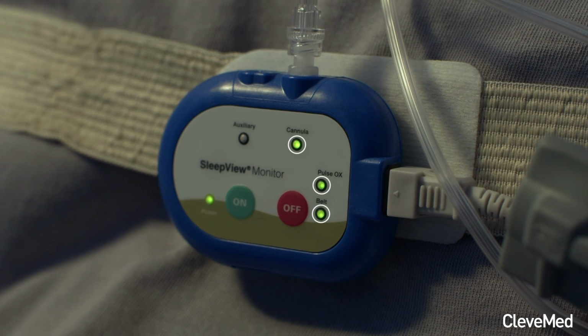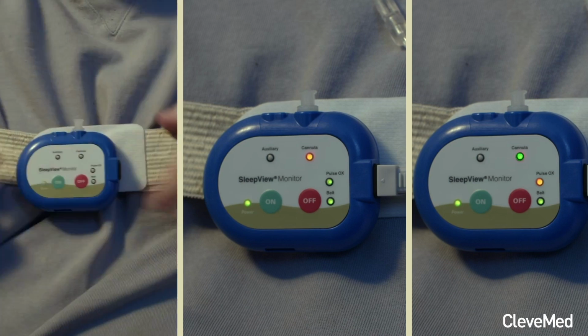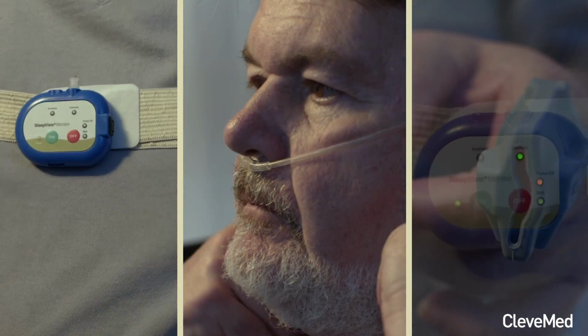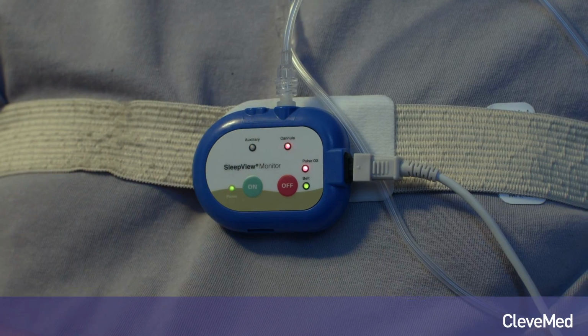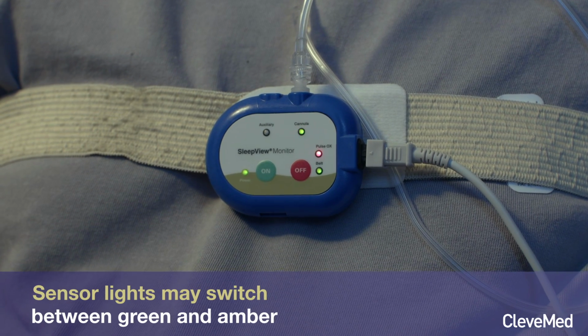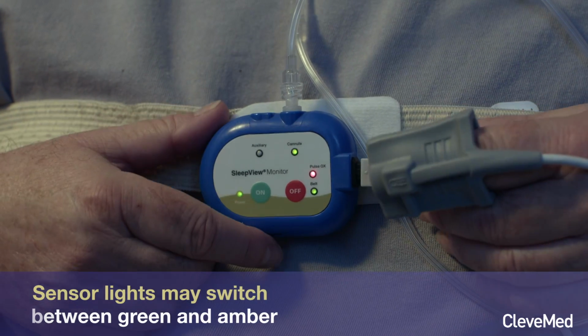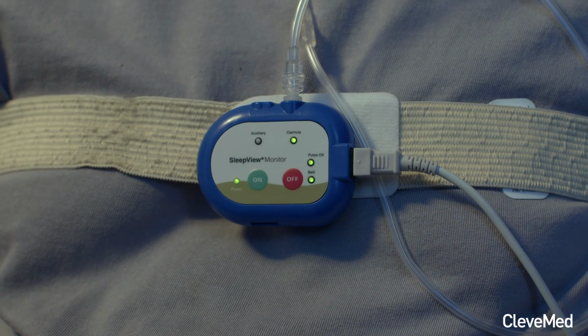If any light stays amber, that means a sensor needs to be adjusted. In this case, locate the sensor and adjust accordingly. However, it is normal for sensor lights to switch between green and amber as you move around. If you notice any sensor lights that are red, that indicates a sensor is not properly plugged in.